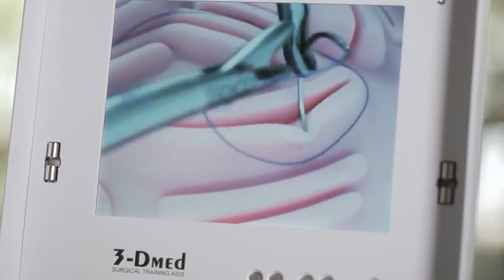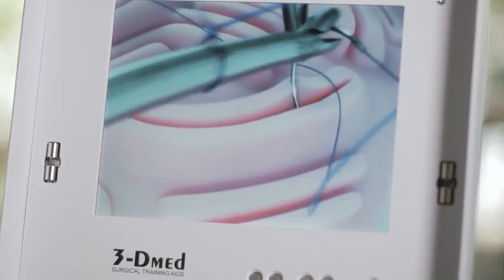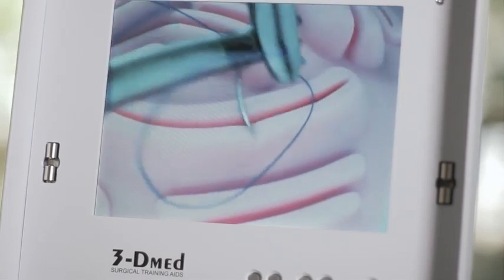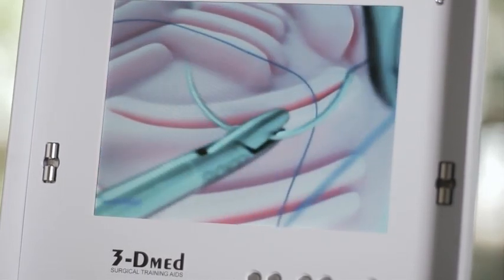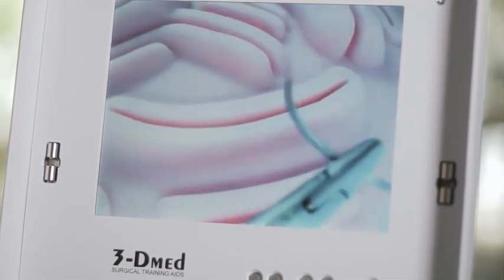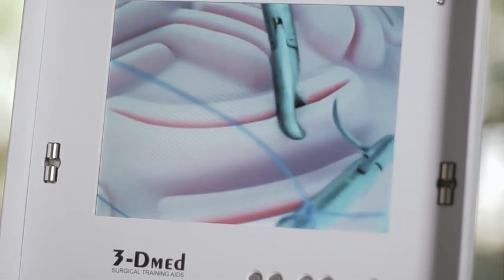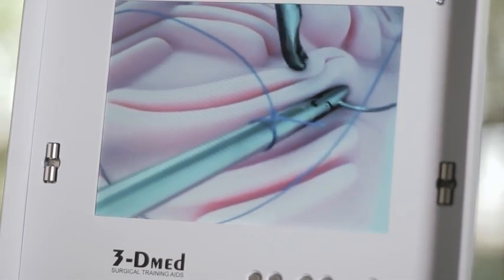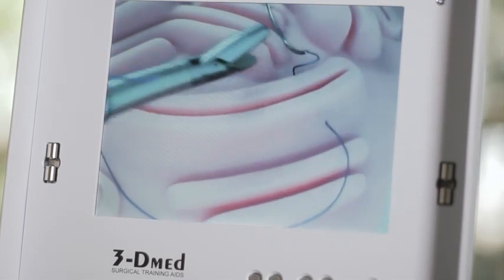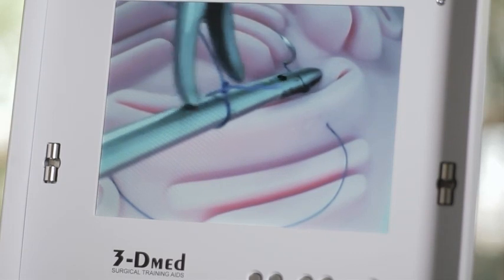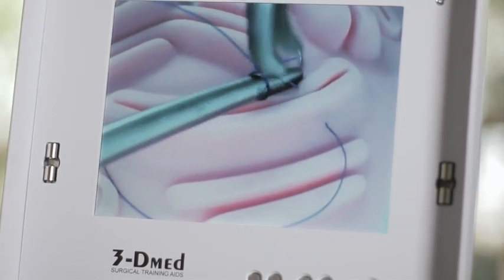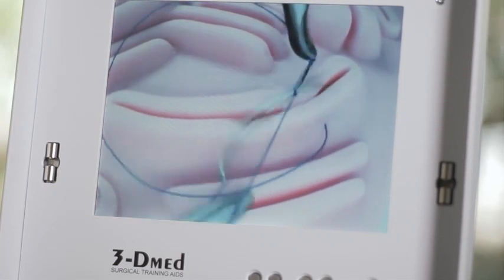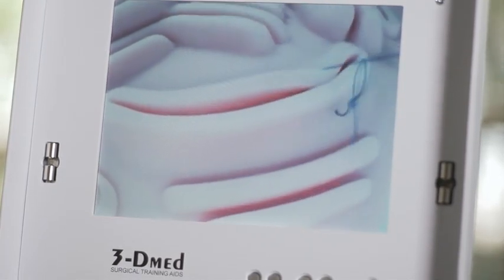Let's go ahead and pass a stitch. I'm going to pick up the needle and you can see it's in the wrong orientation. So I will use my suture to rotate it around and get the right orientation. We'll pass the suture through, say the beginning of the closure of our cystotomy, and pull the needle through the tissue. Then I will hold the suture and advance our lasso over our needle and pull it through the tissue. This obviates our need for passing a knot.